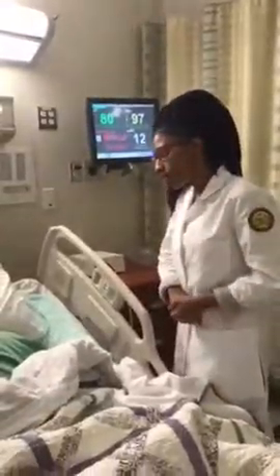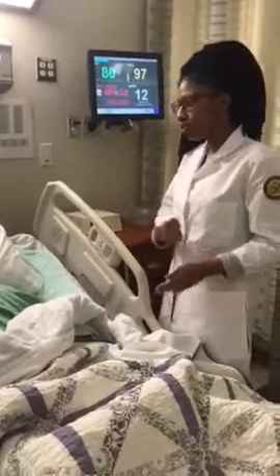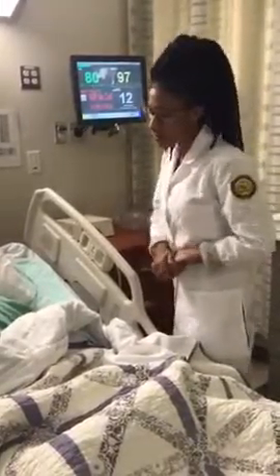Into my patient's room and make sure to provide privacy and introduce myself. Hello, my name's Lizanne. I'm going to be your nurse today. I'm going to be doing a sterile wound dressing change. Can you please tell me your name and date of birth?